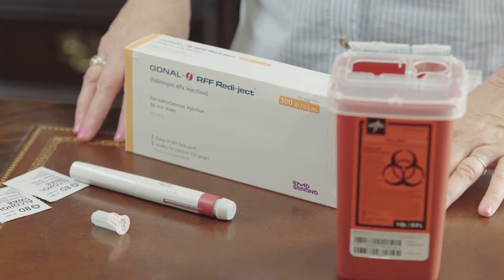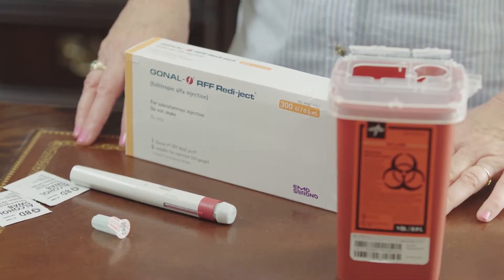I'm going to go over the Gonal-F Readyject Pen. Gonal-F is the follicle stimulating hormone that your doctor prescribed to help develop the follicles on your ovaries.